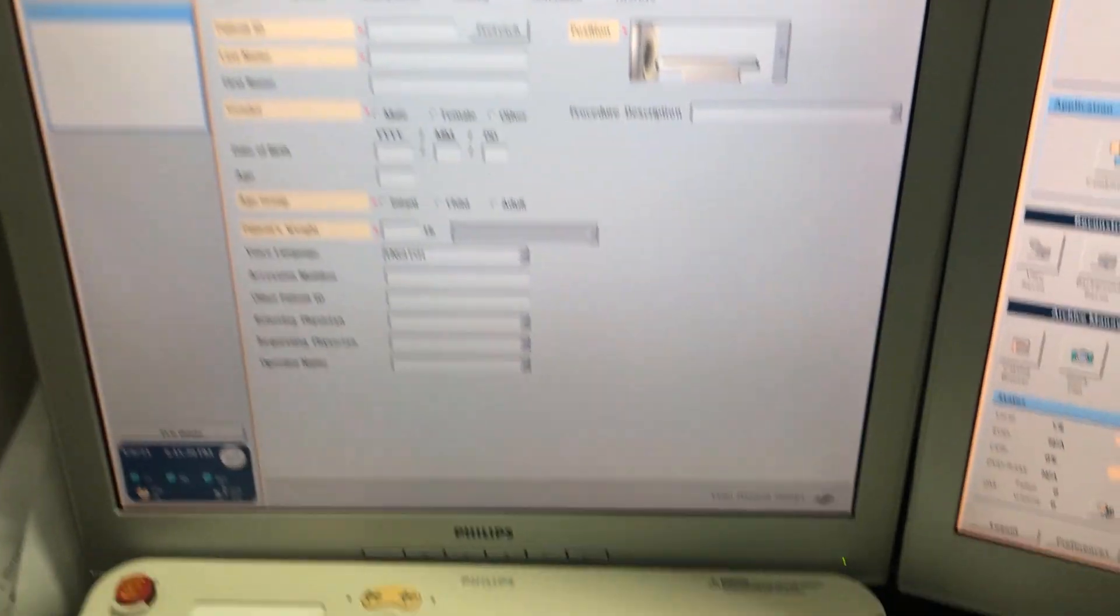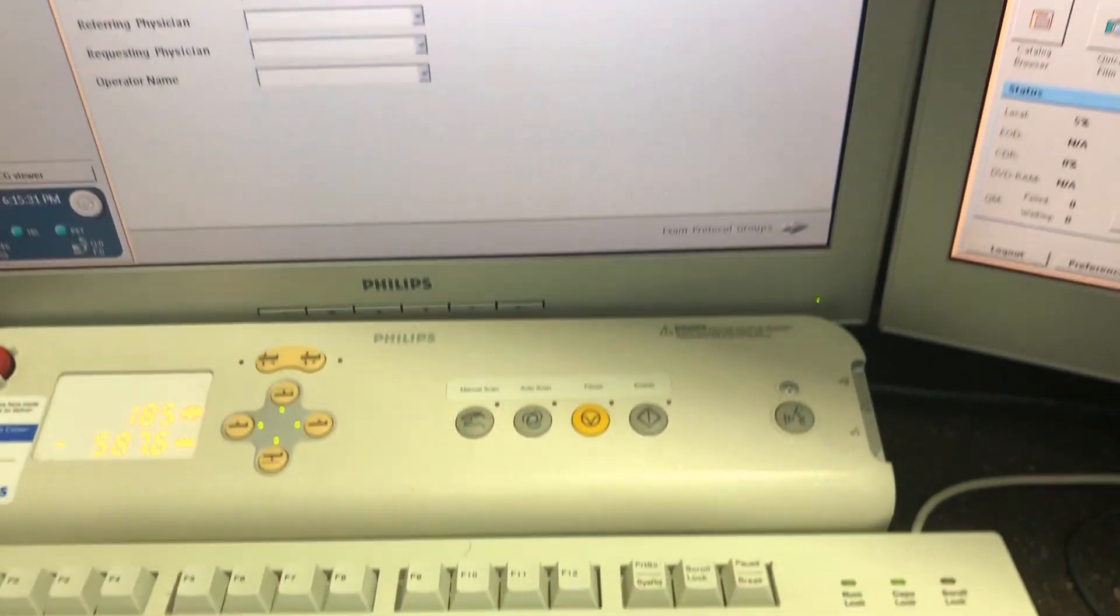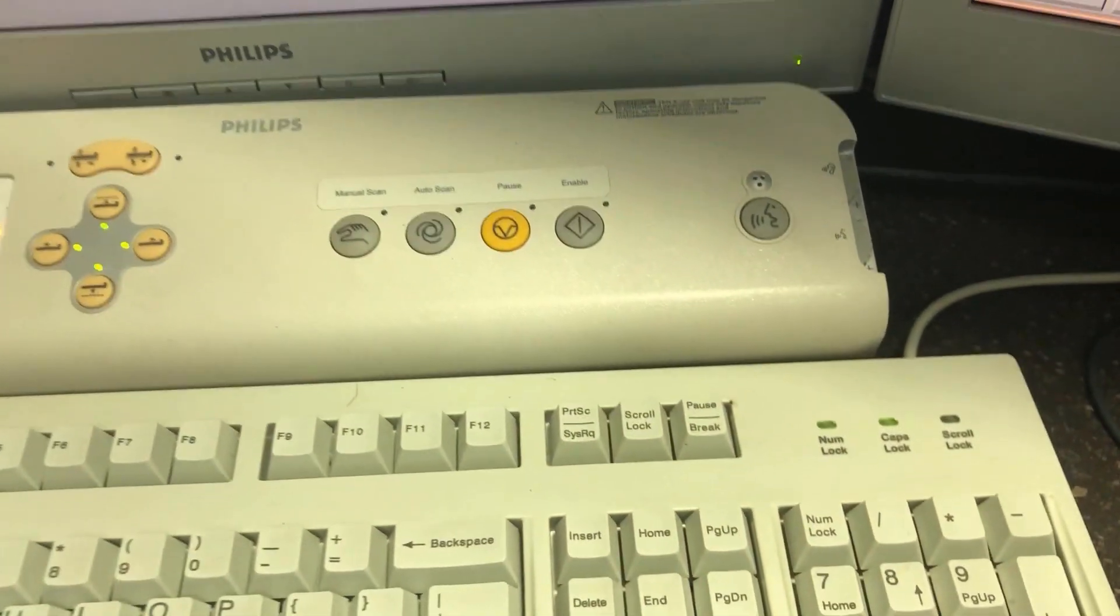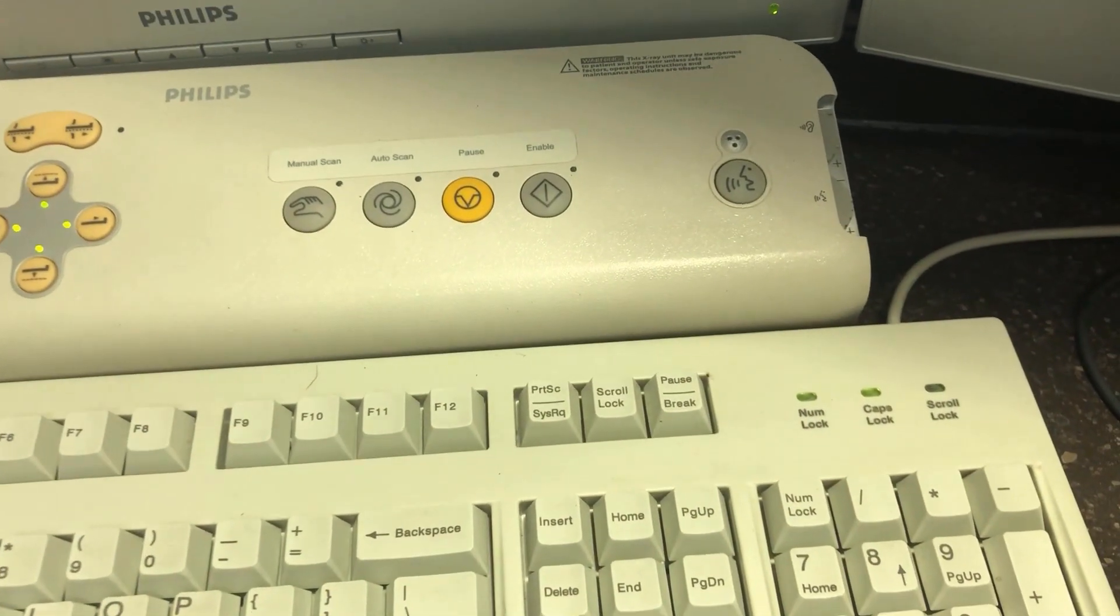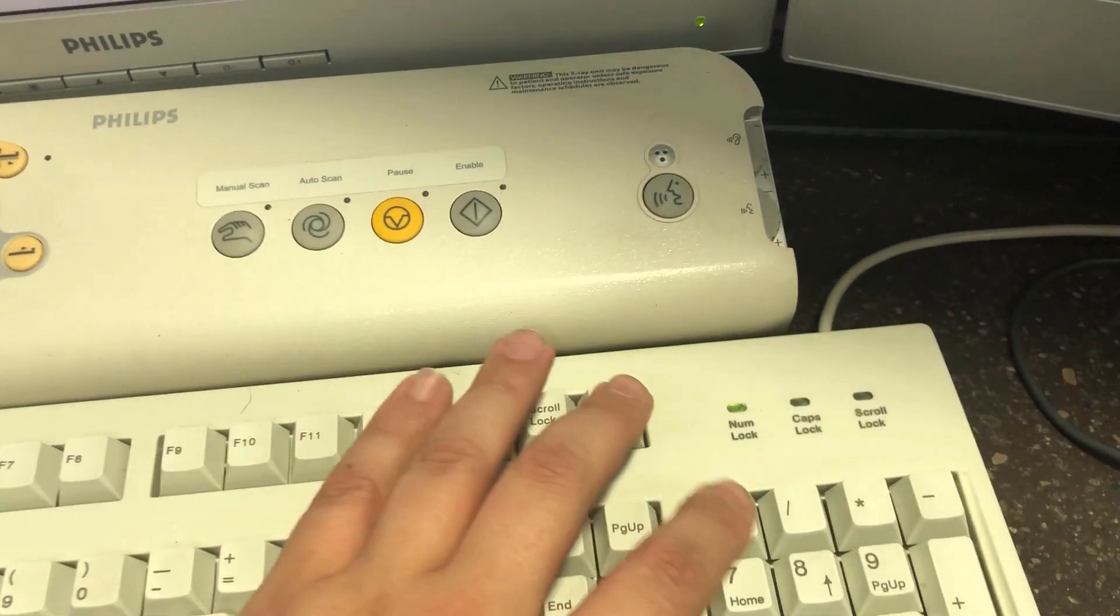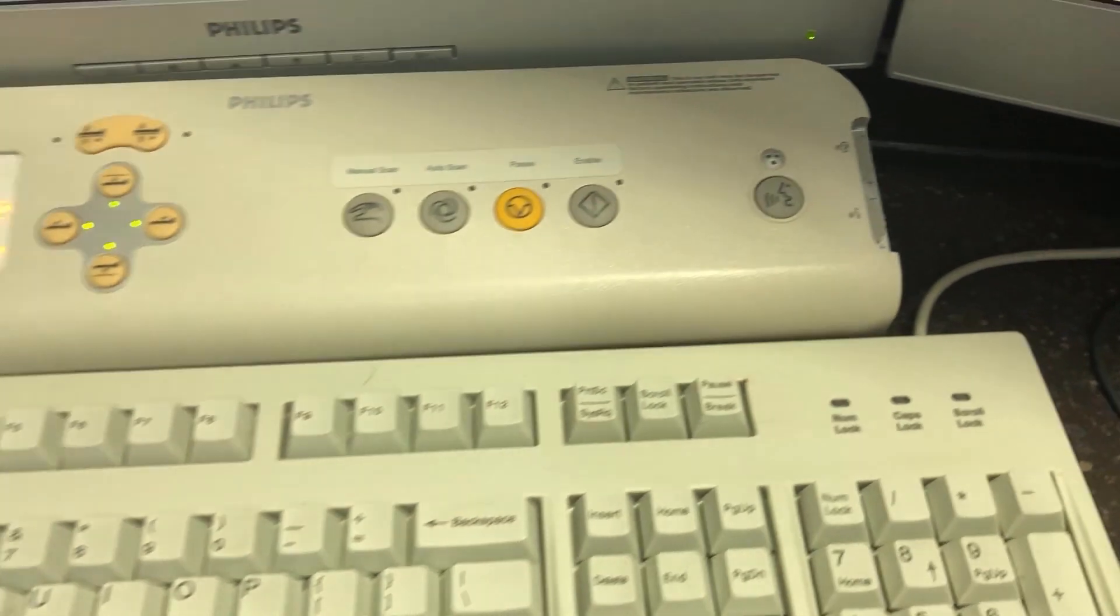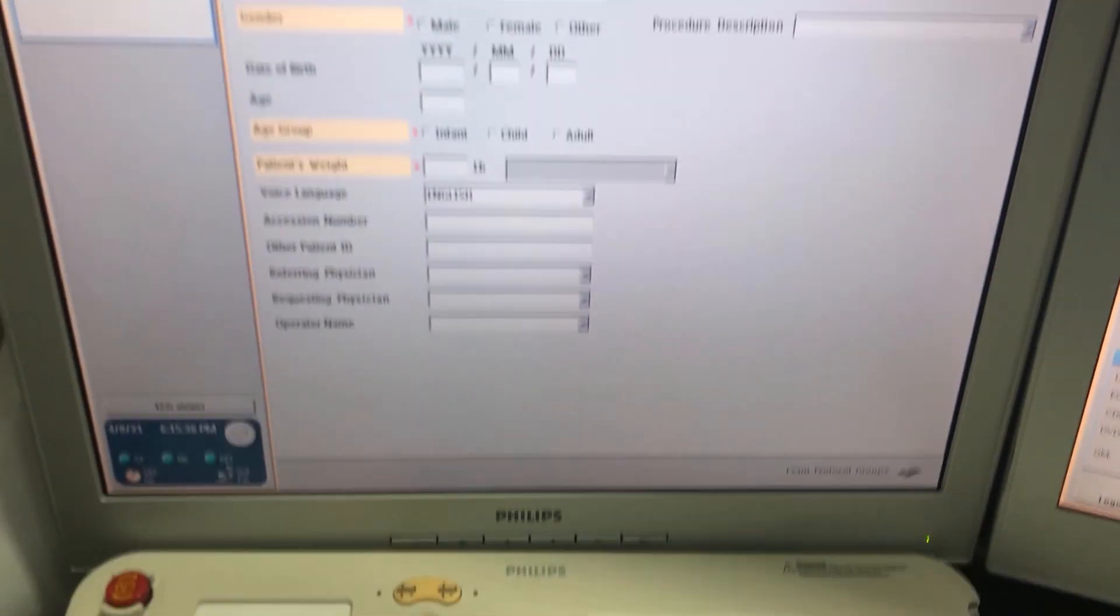Hey everyone, today we're going to go over how to shut down a Philips Gemini PET CT. Okay, first what we're going to do is make sure that the caps lock and number lock is off.